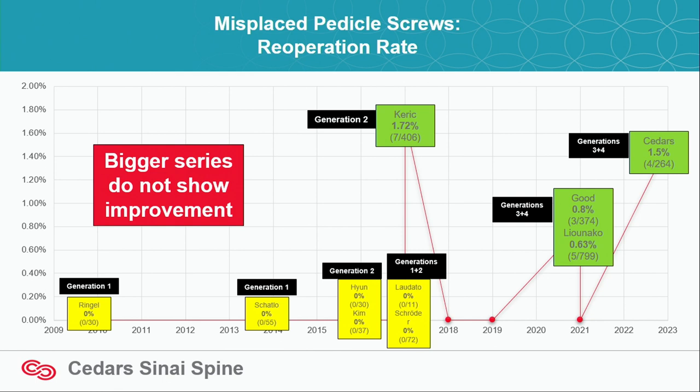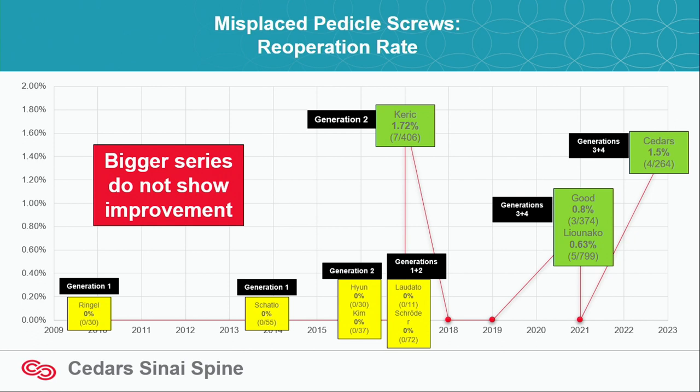We actually had to come to Jesus grand rounds of like, hey, this can't continue. We have to change things now. And here's some of the stuff we learned. And I have to talk about Medtronic robot and Globus robot. Those are the two that I've used and have experience with. I'm not promoting one or the other, but they're different.